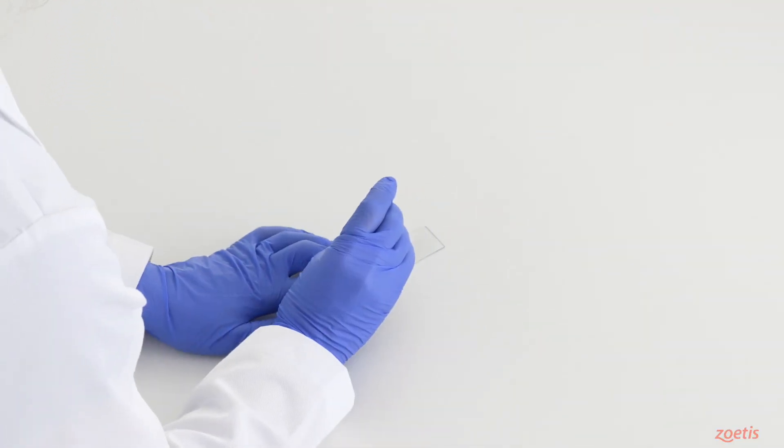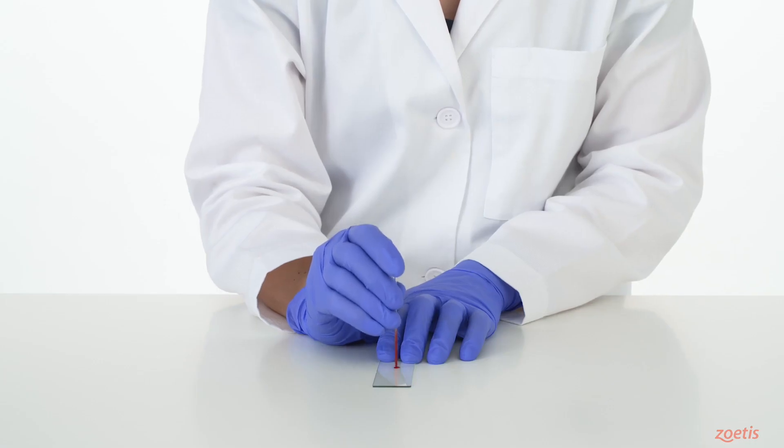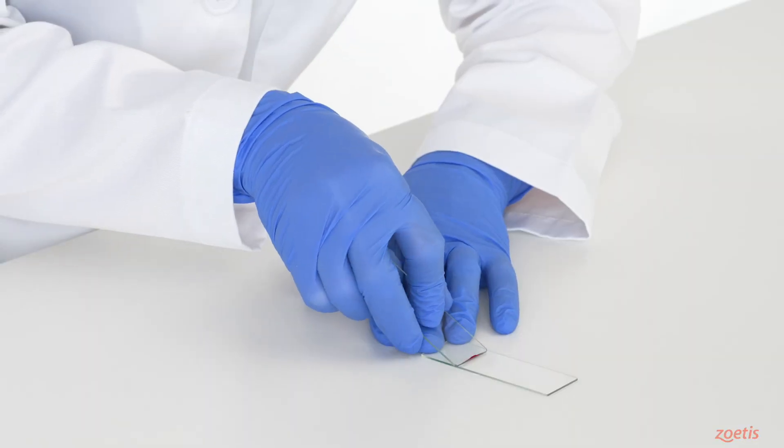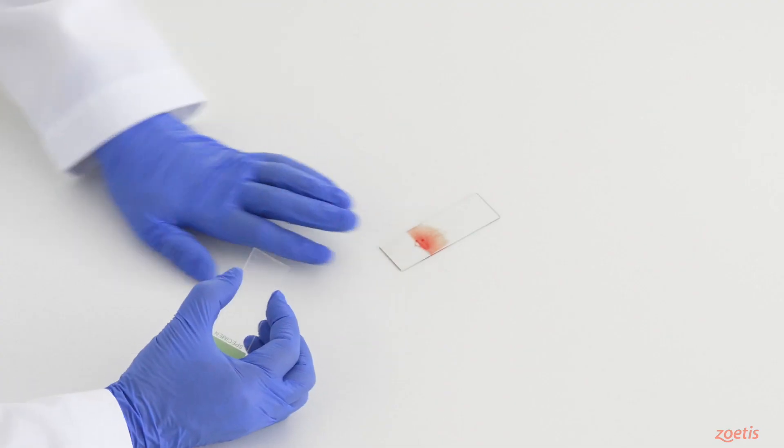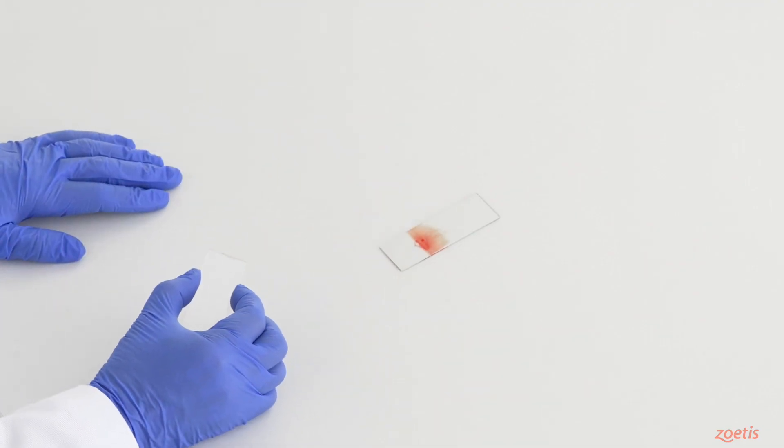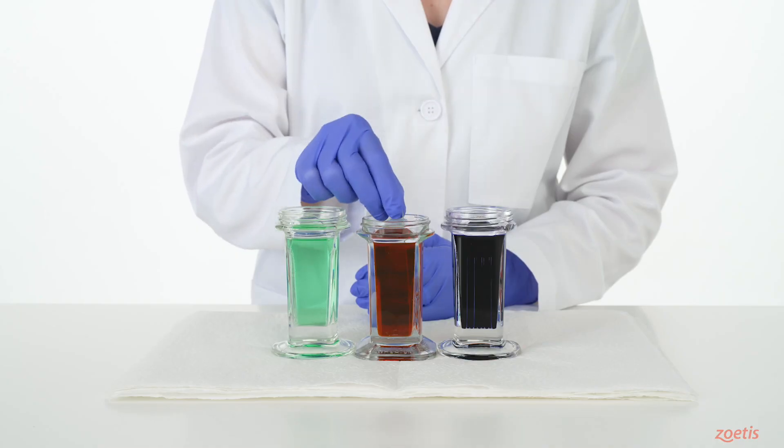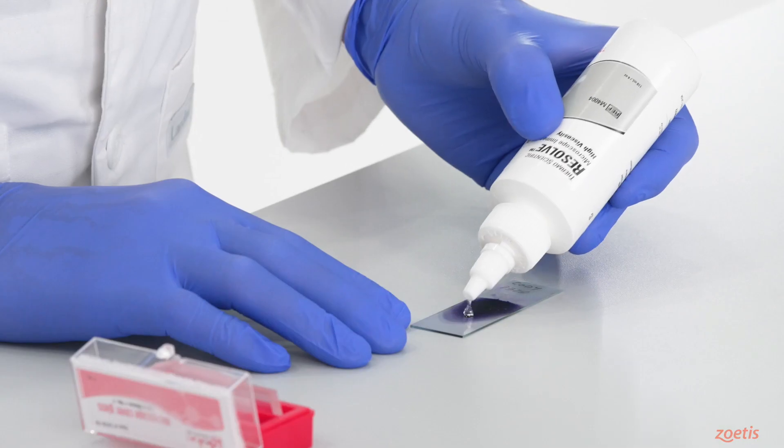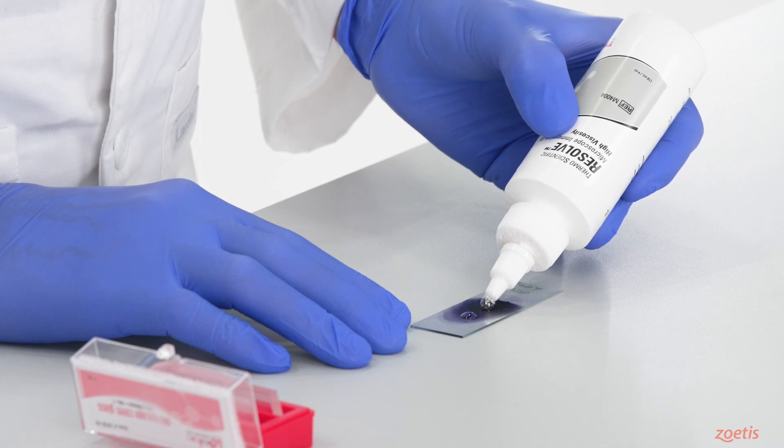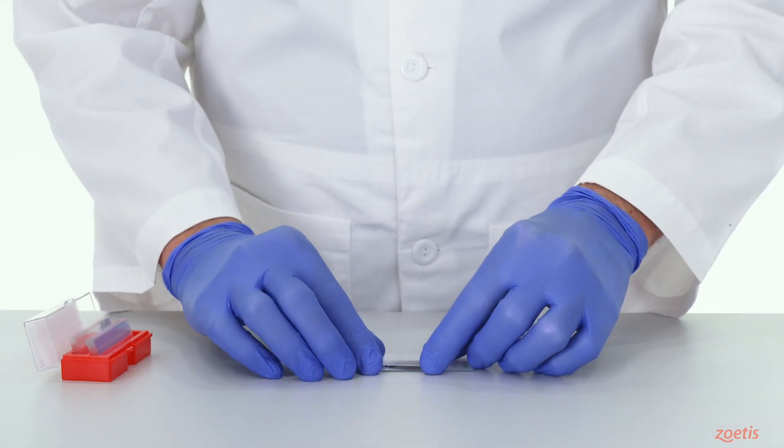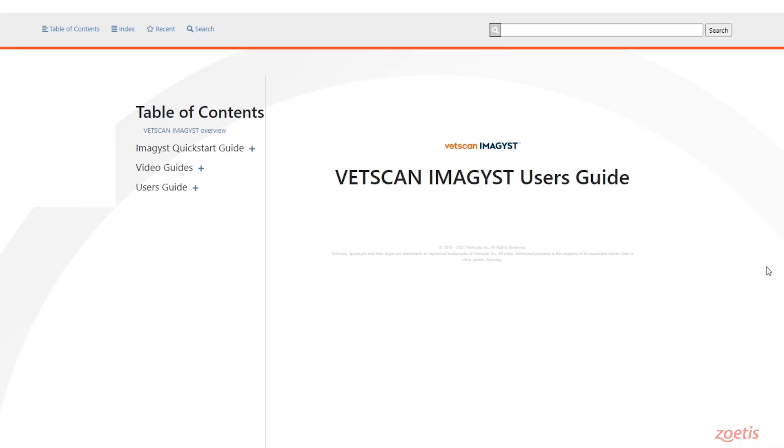The next step is to prepare a cytology slide using industry best practices. After properly preparing your slide and allowing it to air dry, you will need to stain your slide. Once a slide is prepped and stained, add a cover slip. Refer to our how-to videos on preparing a cytology slide in the user's guide.